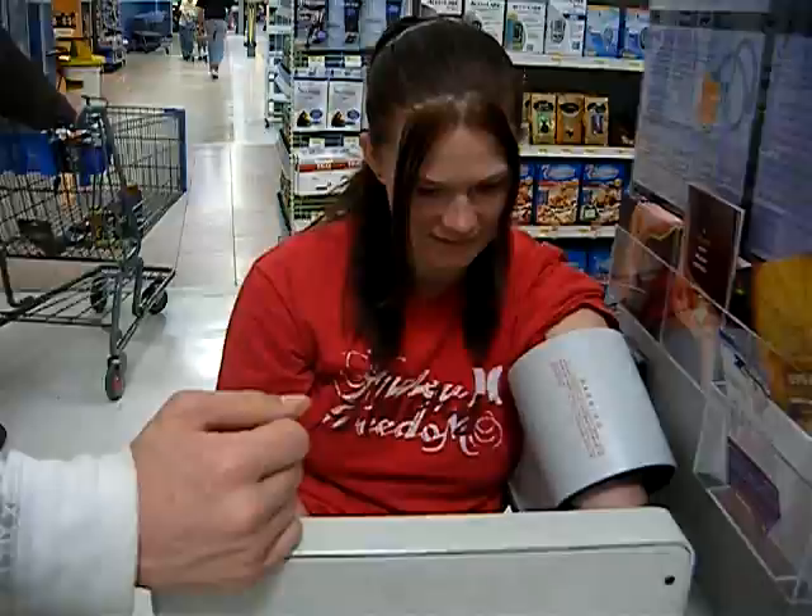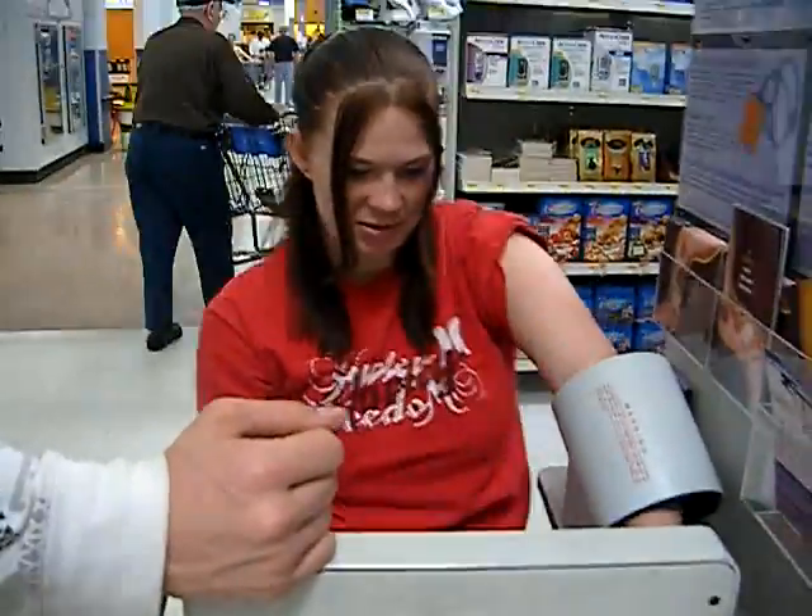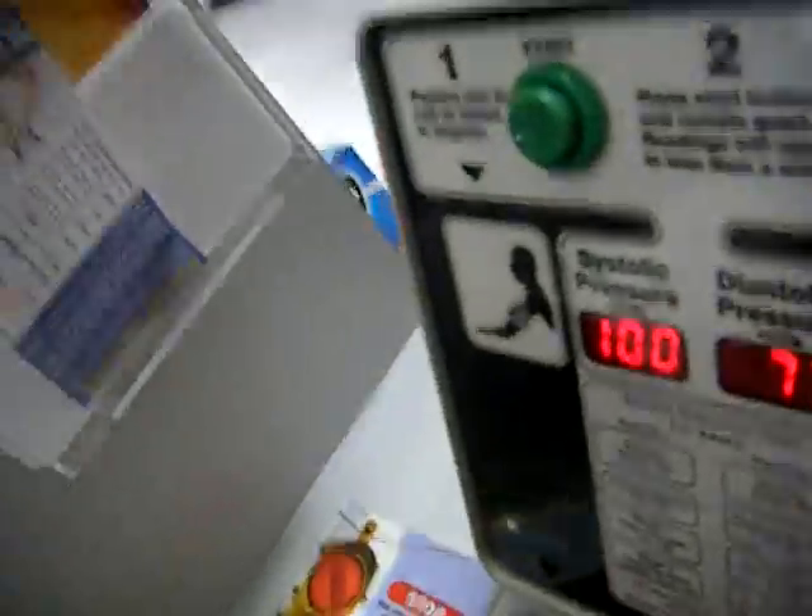Normal is below 120, right? Yeah, so I'm good. Normal is below 80 — I'm good. I had like 127 or 120 every time I go to the doctor's.